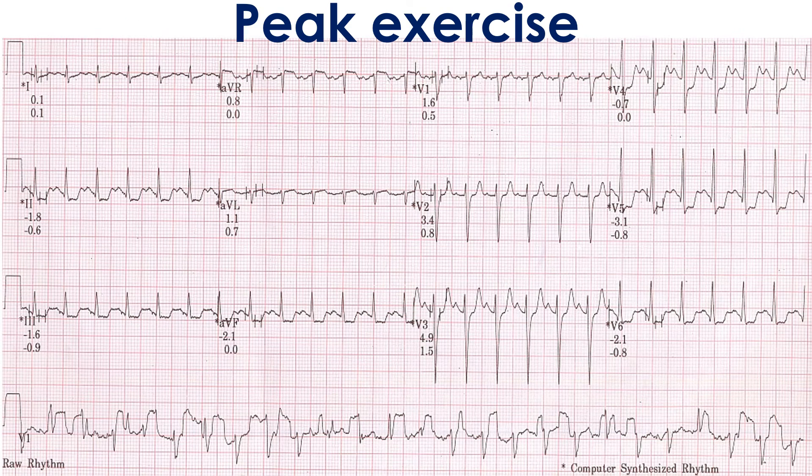Recording at peak exercise shows significant horizontal ST segment depression in inferior and lateral leads at a fast heart rate. However, the significant level of artifacts in the raw rhythm strip makes us suspect whether the ST segment depression could be artifactual due to computerized averaging in the computer-synthesized rhythm.